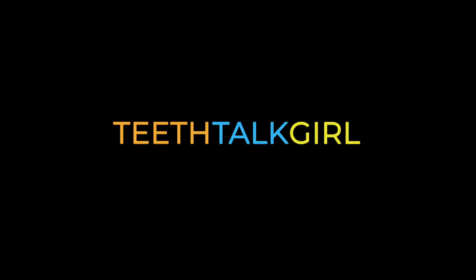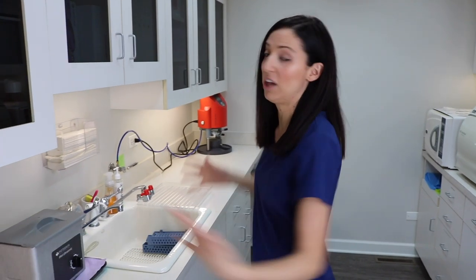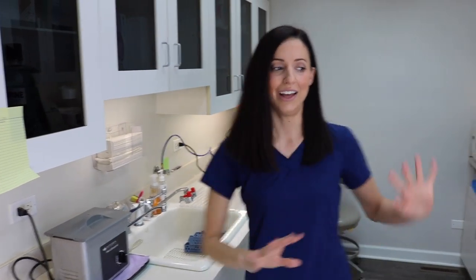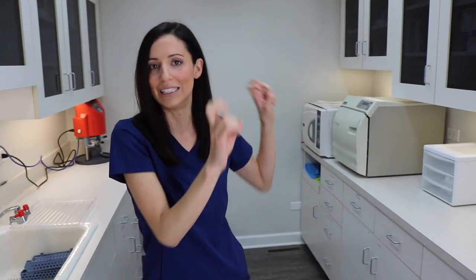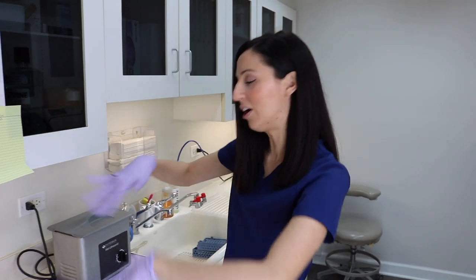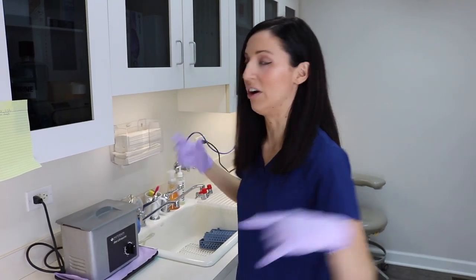This is the sterilization room — this is our third video in this little series about what's in my op. We're lucky to have a very large and spacious one. We have a whole dirty side and then a clean side. Obviously it's not my op, so you should still wear proper PPE: long sleeves, mask, everything, hair up.